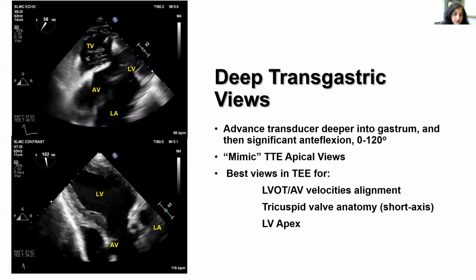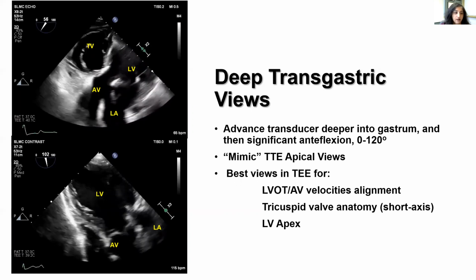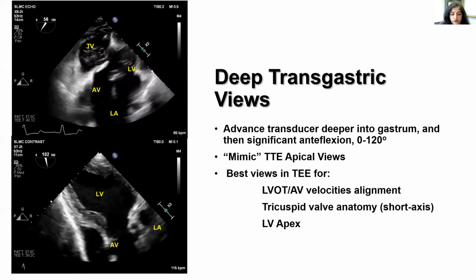It's a great view for tricuspid valve anatomy, particularly all 3 leaflets in short axis. And it can also be a good view for the LV apex, which is the furthest away from the esophagus, but is much closer to the stomach.